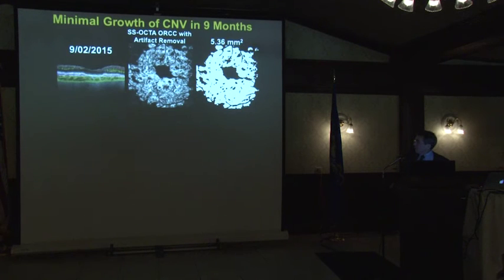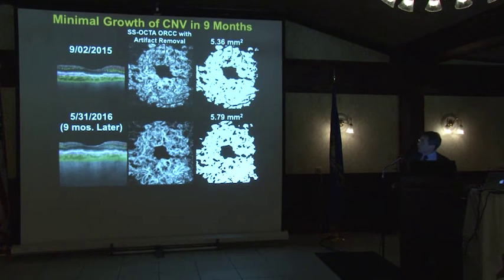All right? And now we follow it over time, and this patient's been followed for 9 months, and it's slowly growing. But it hasn't progressed to exudation yet. Maybe it won't. Maybe it will. But at least we know this is a high-risk patient that needs to be followed closely.